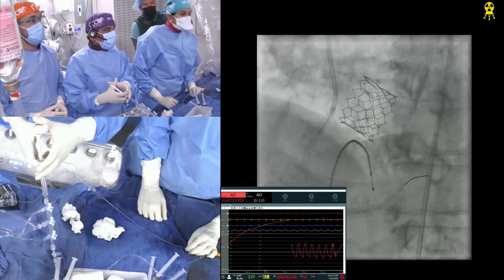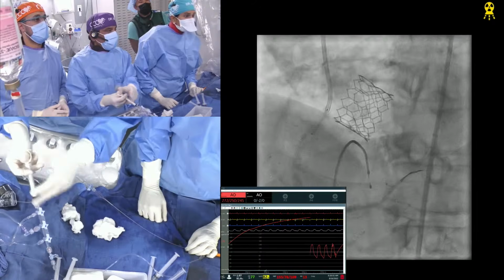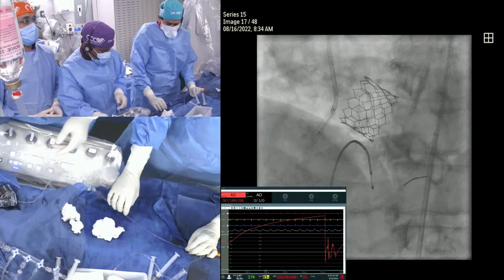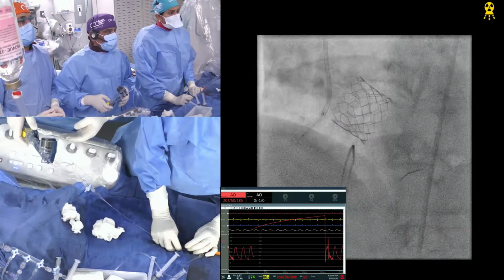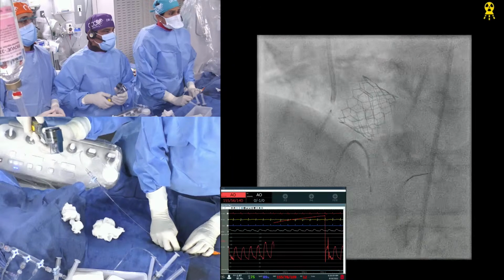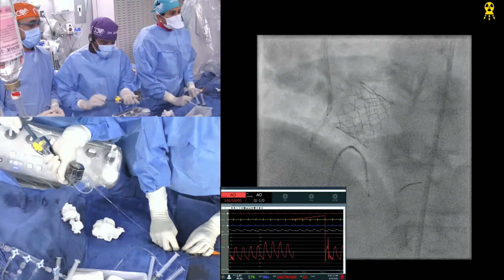And that is what we do nowadays, that angiogram at the time of the TAVR. Okay, right? You have to come back 1 millimeter, good. No, I think I will pull back the guide. Good, right? Yeah. Okay, go. Okay, going up now.